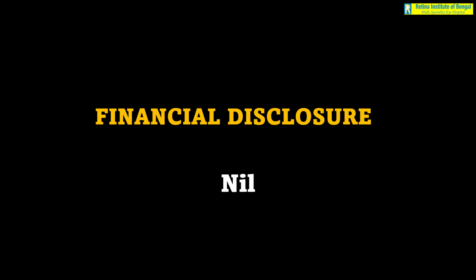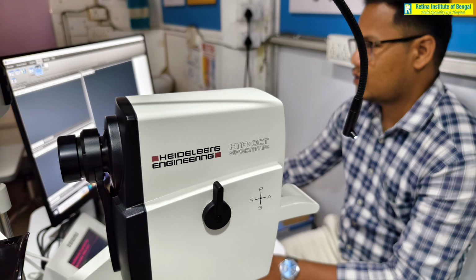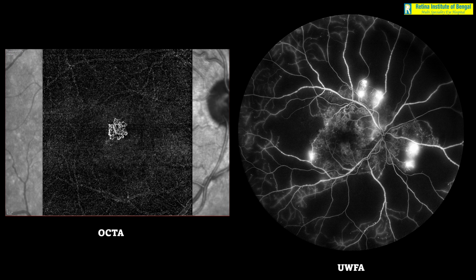So what is multicolor imaging? Last year, in January 2024, our institute installed the Heidelberg HRA OCT machine. The primary reason we purchased this machine were these two diagnostic tests: one was OCT angiography, and the other was the ultra wide field fluorescein angiography facility. These were the two things we were looking forward to introducing in our clinic when we purchased the machine.